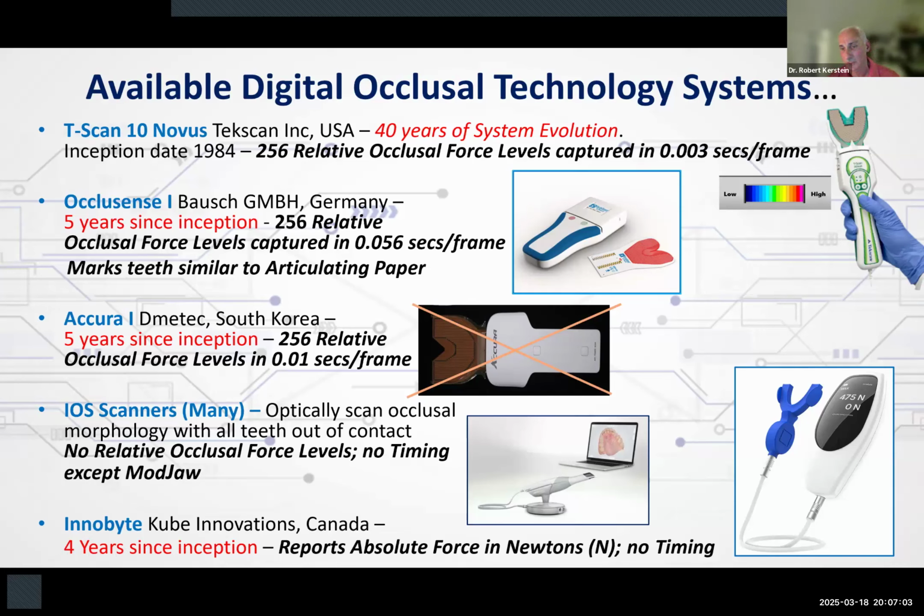There's a digital display showing 475 newtons. It reports in newtons. In simple terms, the patient bites on this silicone pad with strength, and then you get a readout of their capability. And so you get a numeric assessment of their bite strength.